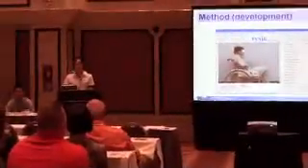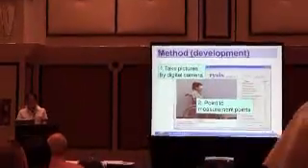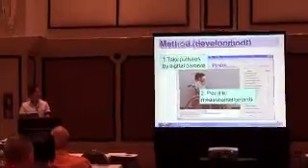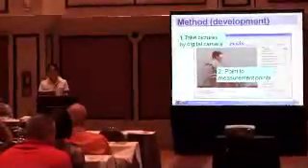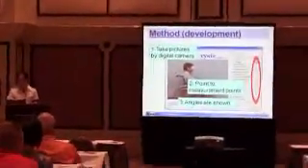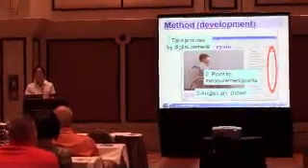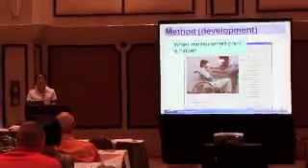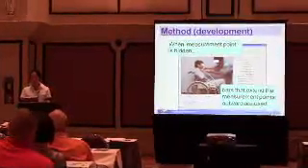Let me introduce how to use it. First, take pictures with a digital camera. Next, point to measurement points, which means landmarks. Point to landmarks, and then here is the calculate button. Push this button, then angles are shown. This angle shows the body segment line. And then, if a measurement point is hidden, parts that extend the measurement point outward are used.